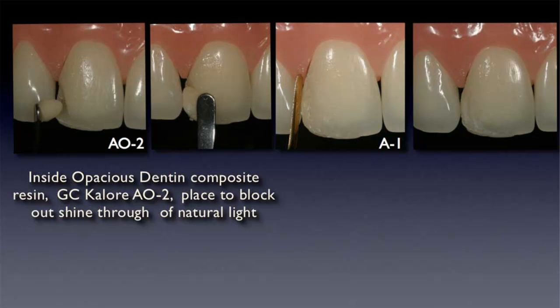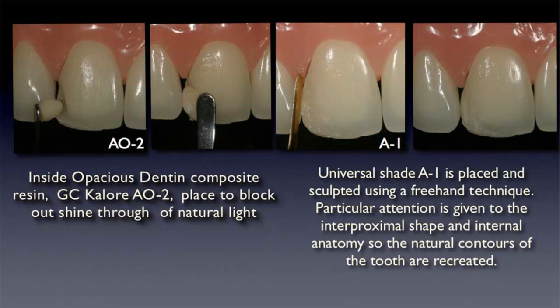And there's another question regarding the bond. Yes, you need to go ahead and do the same thing with the air dry for 10 seconds. And you really got to blast it. Get that air water tip really close so you can blast it so that you're able to then get that water molecule out of there. So that all-in-one type of technology of adhesives, for all of them, you got to do that, or else you will run into a problem with the water tree effect.